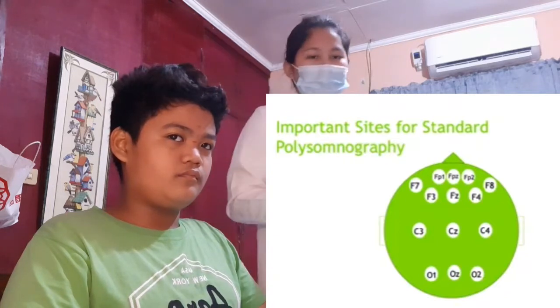Okay, the next part is we will measure between the left and right preauricular points through the first mark made for Cz. Correction, earlier it's not C2, it's Cz, on top of the head, which is the 40 centimeters. This is the part where we will measure the left and right preauricular points.